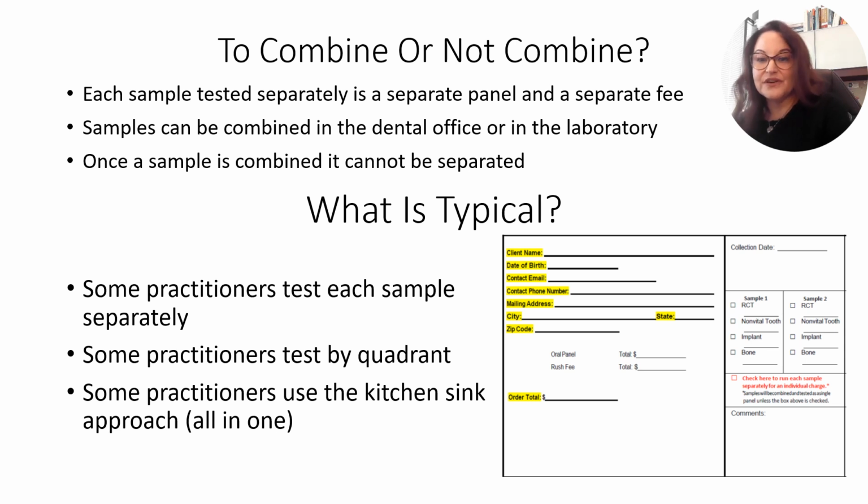To combine or not combine samples. I get this question a lot from practitioners, and they want to know what other practitioners do. Each sample tested is a separate panel and a separate fee. Samples can be combined either in the dental office or in the laboratory. Once a sample is combined, it cannot be separated.